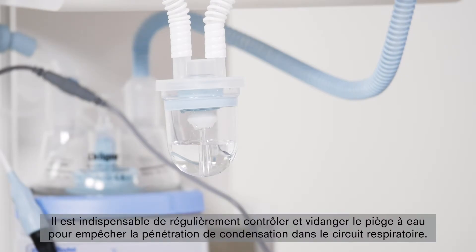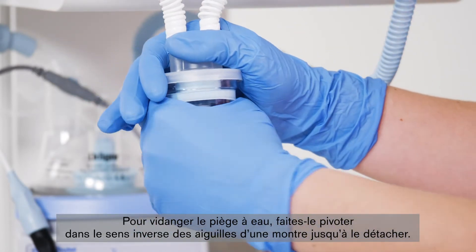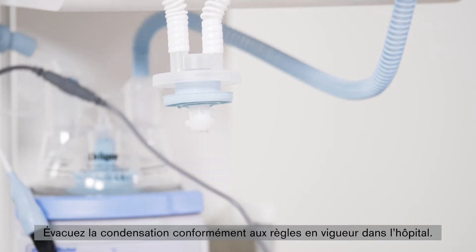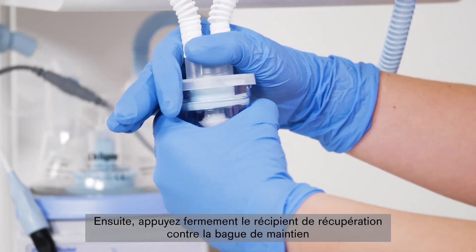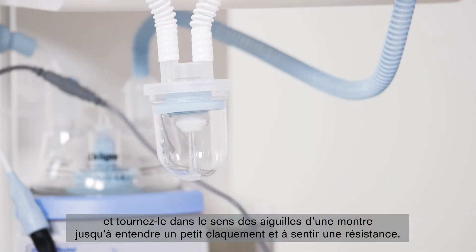Regular inspection and emptying of the water trap is essential to prevent condensation from entering the hose system. When emptying the water trap, turn it clockwise until it can be removed from the connection. Dispose of the condensation in compliance with hospital regulations. After emptying, press the collection container horizontally and firmly into the locking ring and turn it anti-clockwise until the container snaps into place and a marked resistance can be felt.